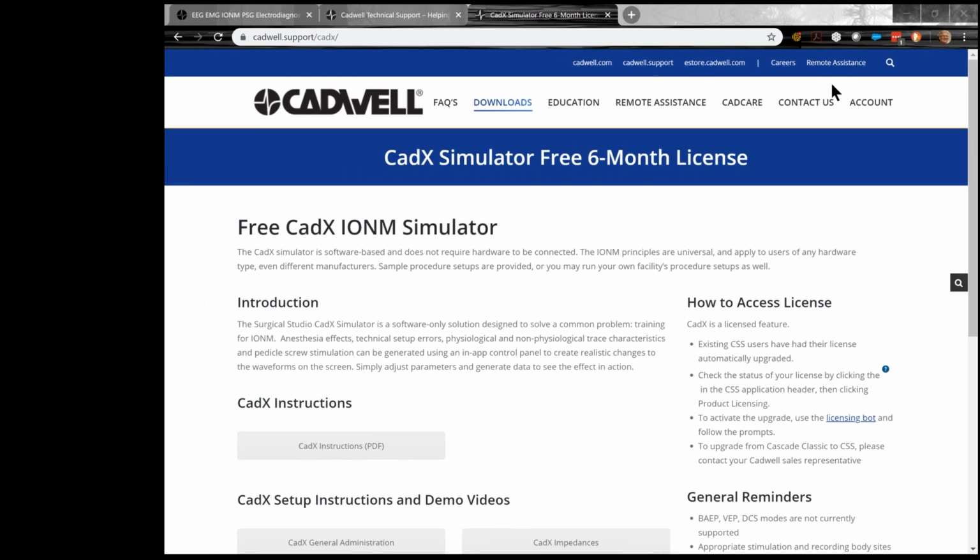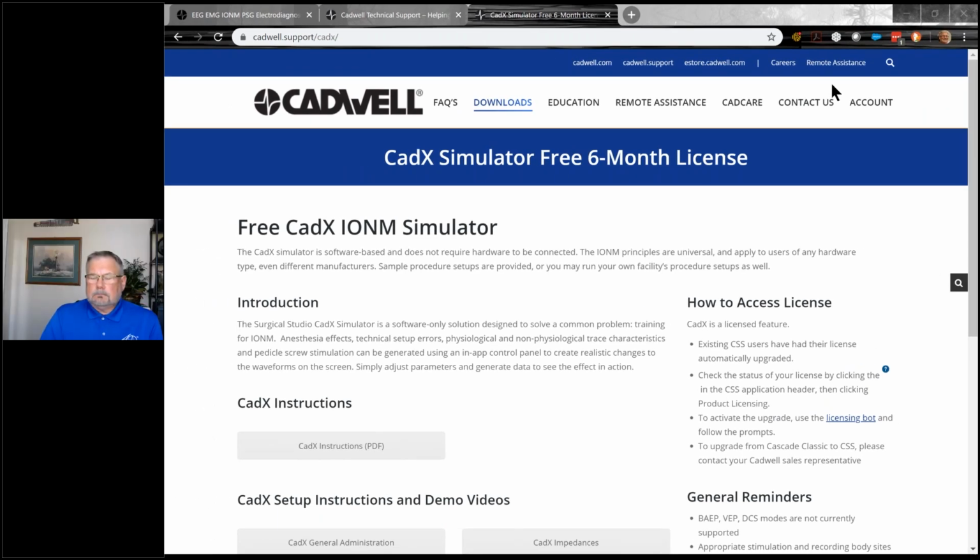All right, do have another one. John Clark has a question. Hi, thank you very much for the presentation. I'm JP Clark from University of California, San Francisco. I wanted to know if you're hooked up to a patient, you're running a case, whether you can drop and review another case while contemporaneously monitoring another. Yes, you can, absolutely. You could be doing review of another case at the same time that you were monitoring one, for sure. Great, thank you. Yes, sir.